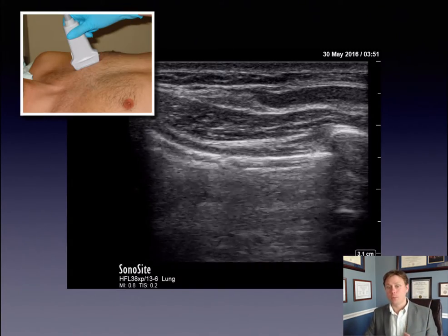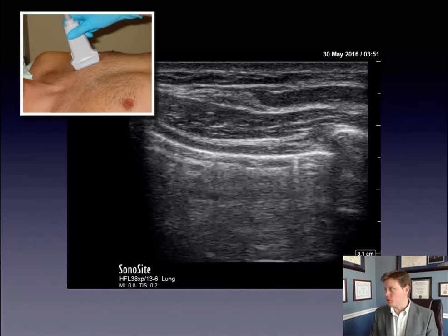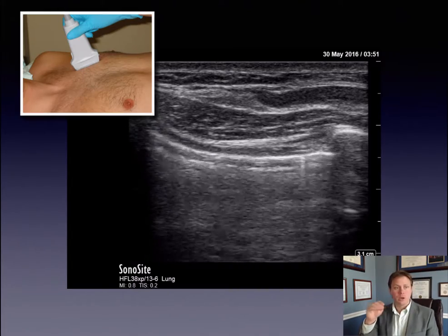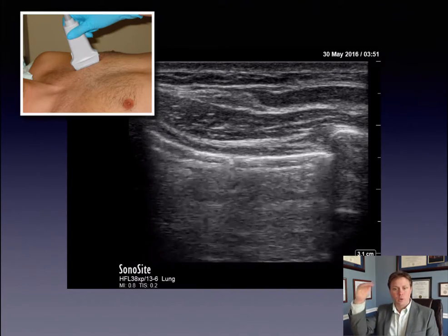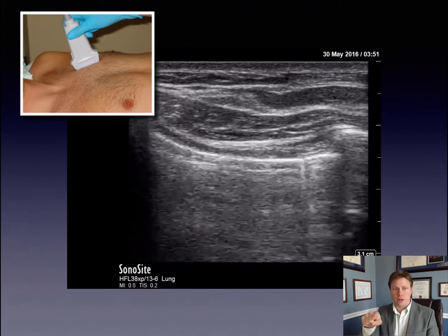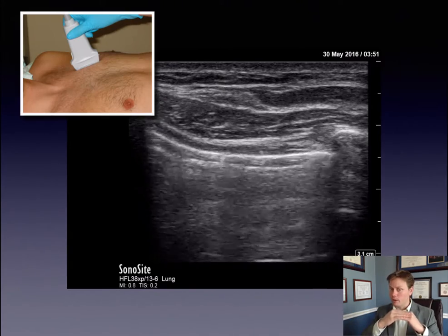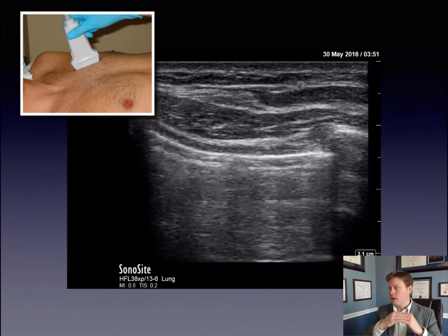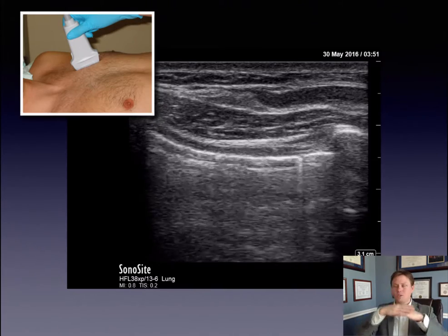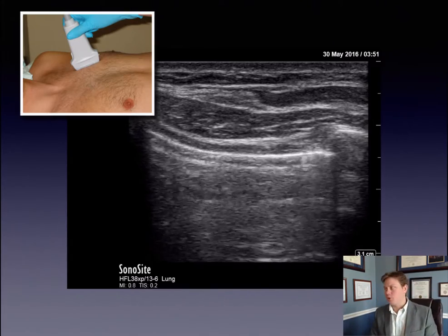So this is what a normal high-frequency linear transducer will give you of normal lung sliding. From top to bottom there, we have skin, soft tissue, intercostal muscles. We see on the right side a rib that's bright white and hyperechoic, casting a shadow, and a bright white horizontal line just below that, representing the two layers of the pleura, which in normal aerated lung are opposed to each other. And you can see them actually sliding back and forth as the patient breathes in. Sometimes it's referred to as ants marching on a log, and you'll cast little tiny comet tails beneath it.